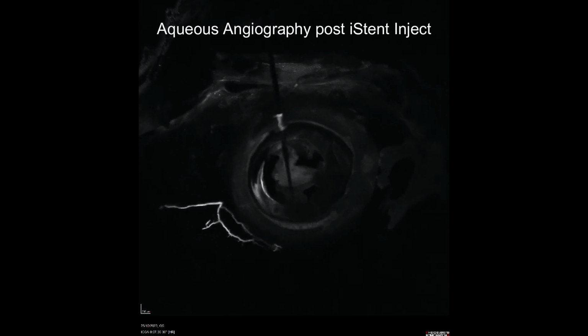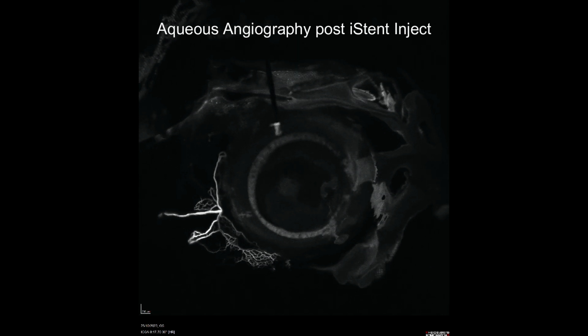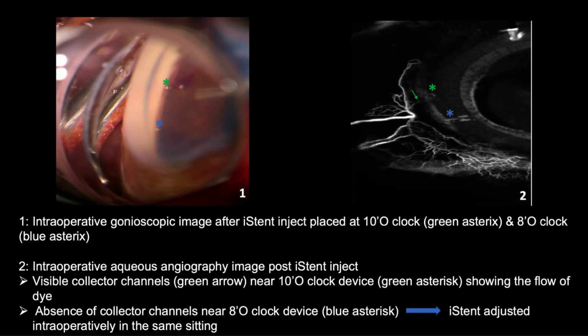Aqueous angiography performed post iStent inject. Comparative gonioscopic image after iStent inject and the aqueous angiographic image post iStent inject showing visible collector channels denoted by the green arrow near the 10 o'clock device and absence of collector channels near the 8 o'clock device denoted by the blue asterisk. This iStent inject was adjusted intraoperatively in the same sitting.